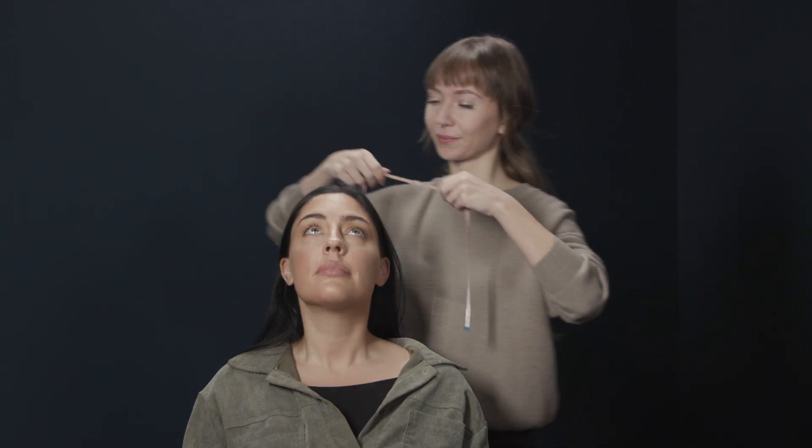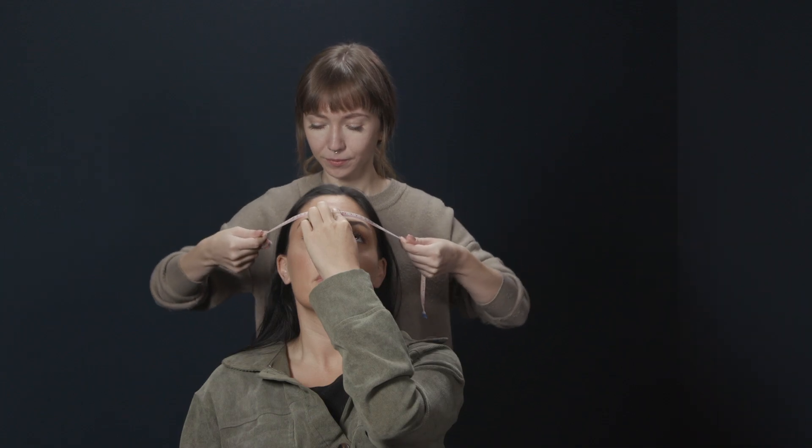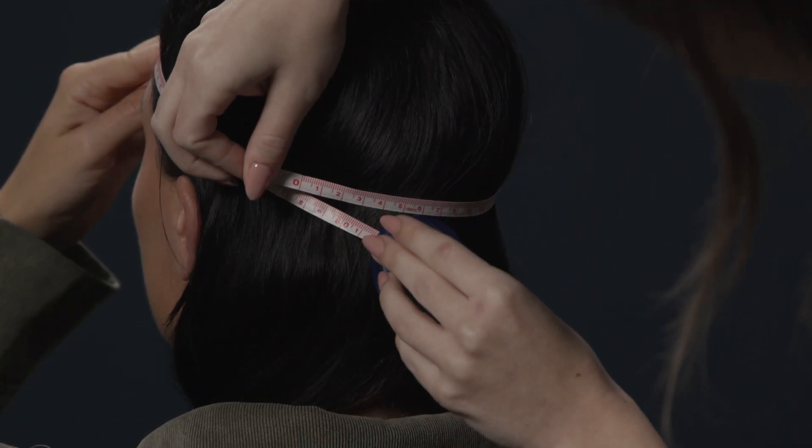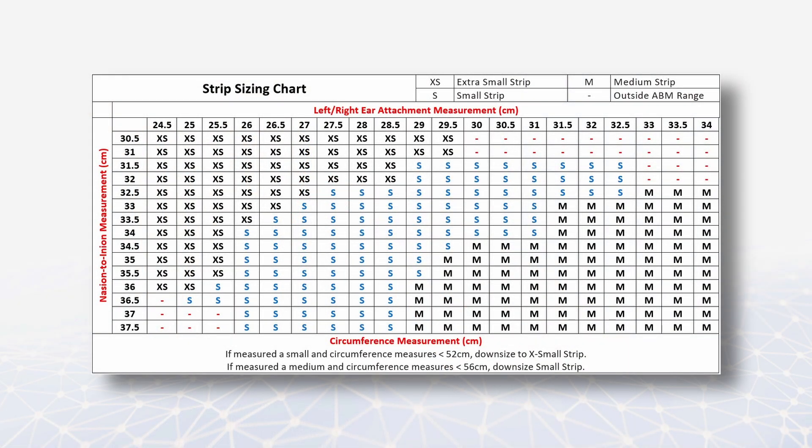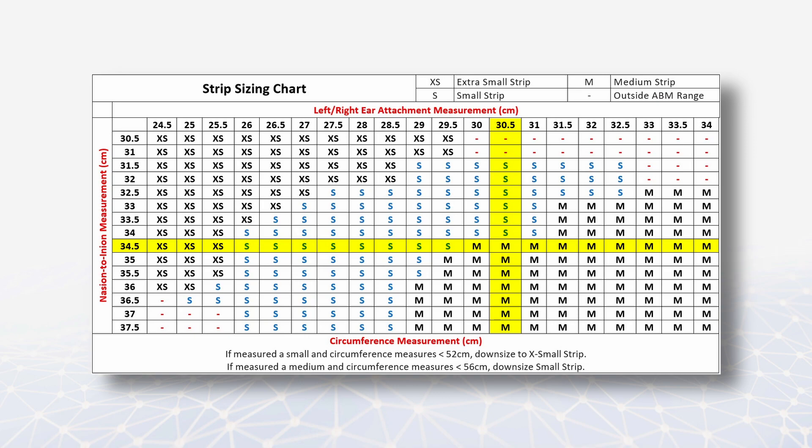Then measure the circumference. Ask the subject to look up slightly and line the tape up just above the eyebrows. It may be helpful to ask the subject to place their finger on the tape to prevent it from moving. Wrap the tape around the head right above the ear attachment and connect just above the inion. Record the value. Use the strip sizing chart provided with your system to determine the appropriate strip size. Find the recorded nasion to inion value on the y-axis and the top of ear attachment value on the x-axis. Locate the point where the two values intersect to identify the subject's appropriate strip size. Some head shapes and sizes may require an adjustment. For medium head sizes with a circumference less than 56 cm, downsize to a small strip. For small head sizes with a circumference less than 52 cm, downsize to an extra small strip.